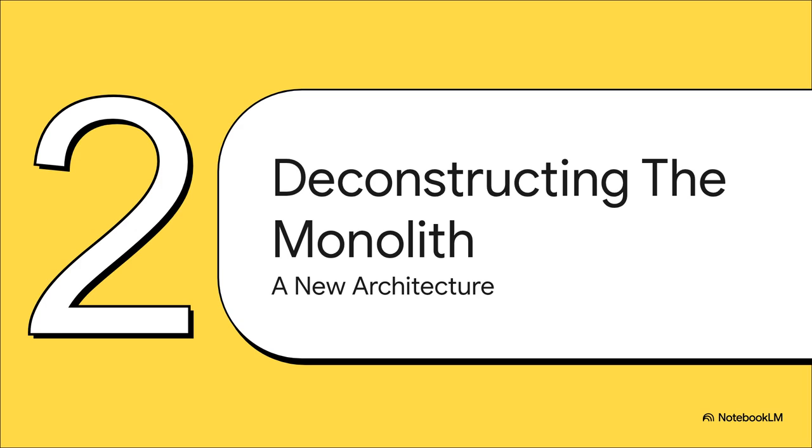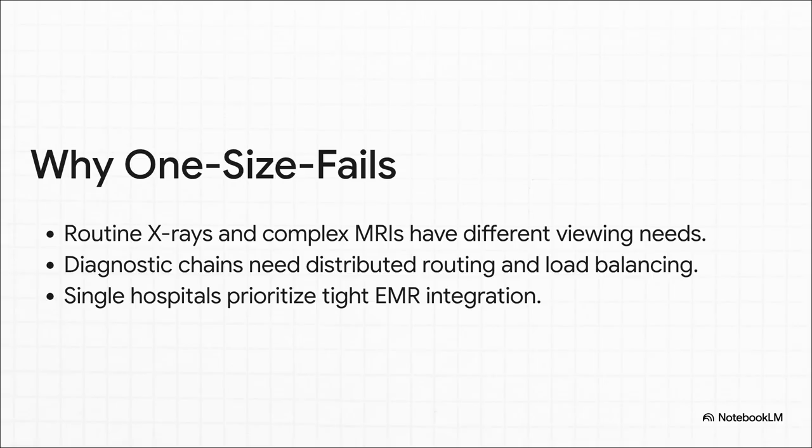It's time to deconstruct. Let's look at why this one-size-fits-all approach just doesn't cut it in the real world. A radiologist who's just reading simple x-rays all day needs a super fast, lightweight viewer. But a neuroradiologist analyzing a complex brain MRI, they need powerful, advanced 3D visualization tools. A big chain of clinics needs to balance workloads across different cities, while a single hospital might just care about tight integration with its own EMR. A monolith forces every single one of them into the same clunky, ill-fitting system.